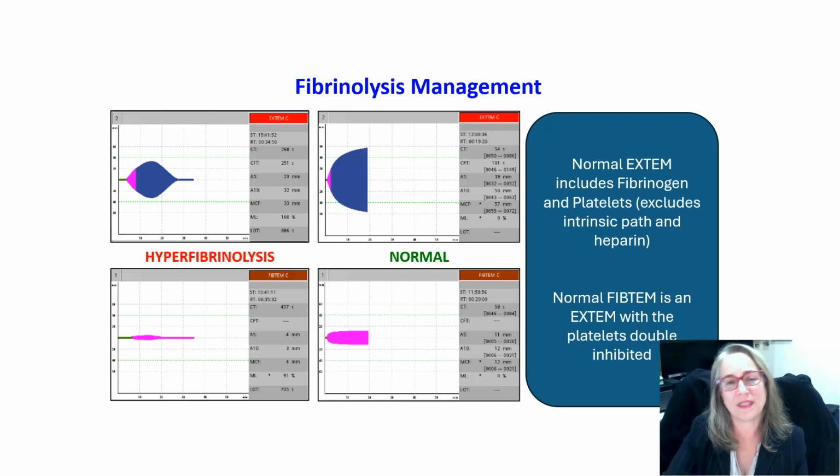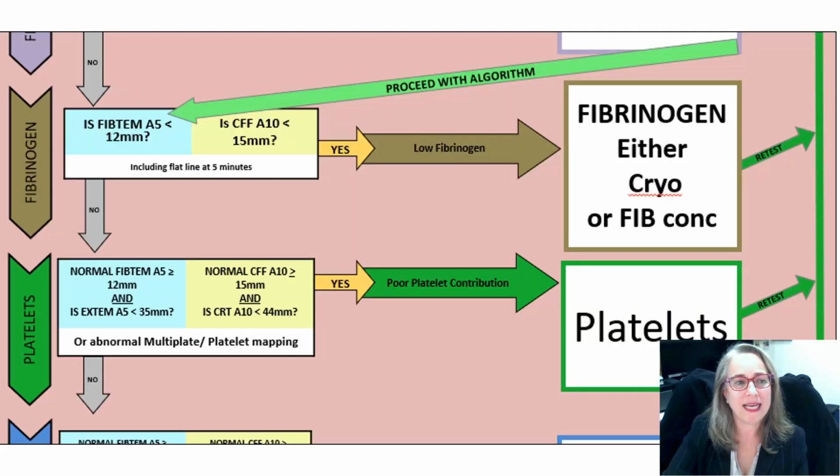Thinking of a sausage on the barbie, it's a chipolata, a little short sausage that comes and then disappears. And one of the speakers, James Winnells from Queensland, does a great talk about explaining it like that. So if you think about it coming and going, it tapers away, and that is a fibrinolysis trace.